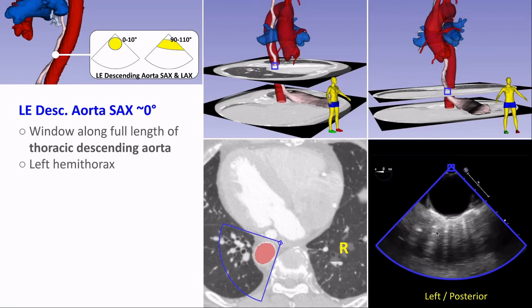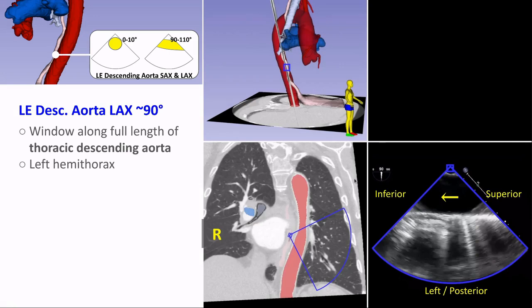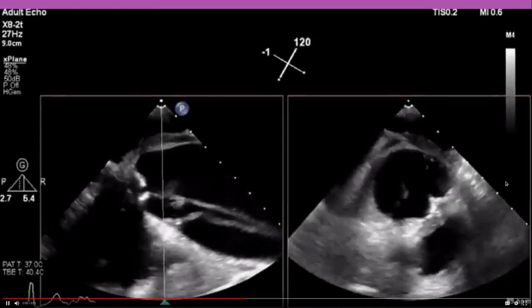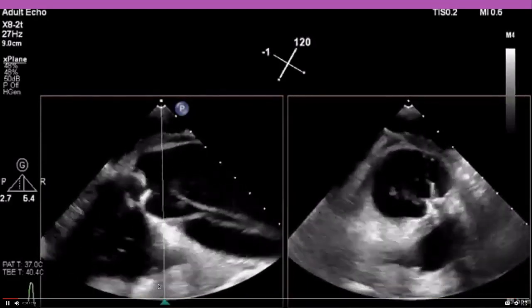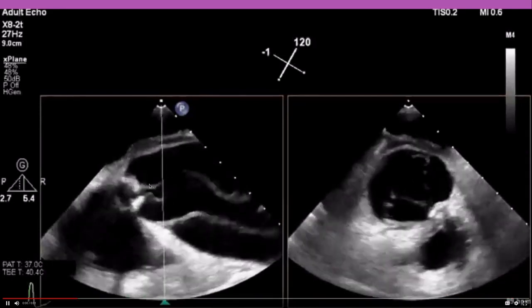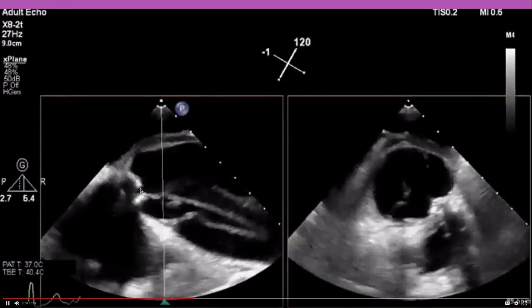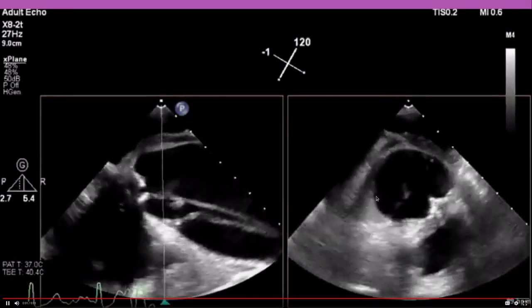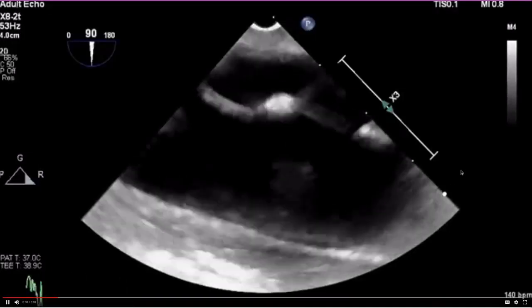Images of the descending aorta can be obtained anywhere from the lower to the upper esophagus, allowing imaging of nearly the full length of the descending aorta. This is where type B dissections, significant atherosclerosis, and aneurysms are commonly diagnosed. In the long axis view, blood flows right to left. In these examples you can see a dissection with heavily calcified valve, dissection flaps coming close to the valve leaflets, a very small true lumen between the flaps, a potentially circumferential false lumen, and a dissection flap in the descending aorta.